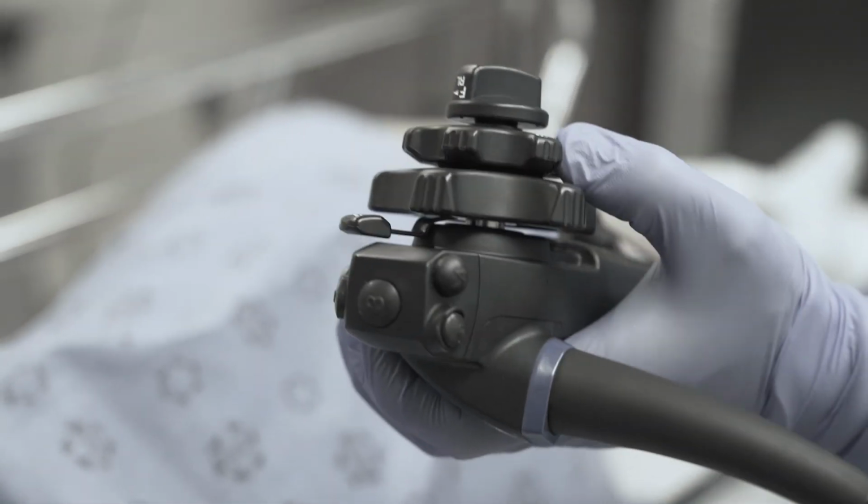We hope that this video helped you to visualize some of the dynamic changes to the colon during colonoscopy, and that you might be able to utilize some of the techniques shown here to enhance your own skill set.